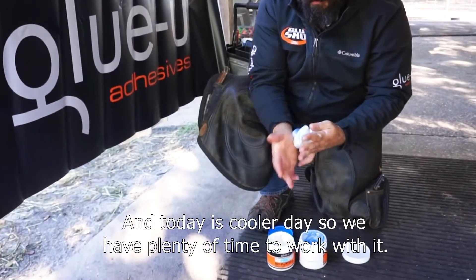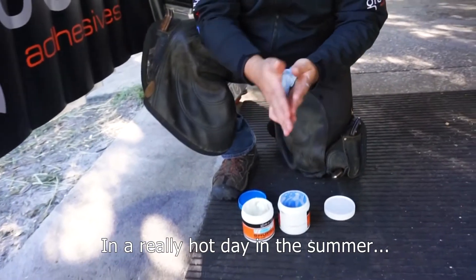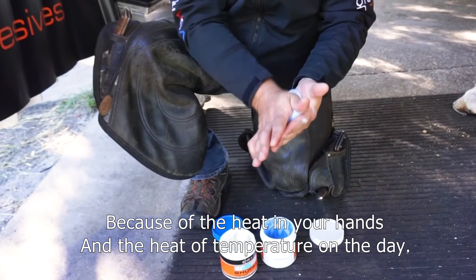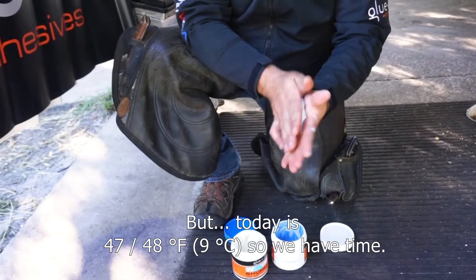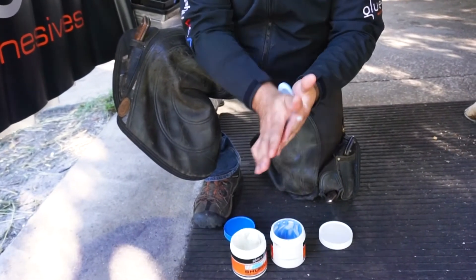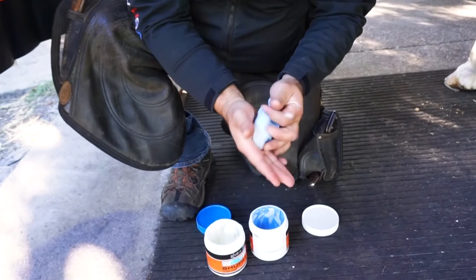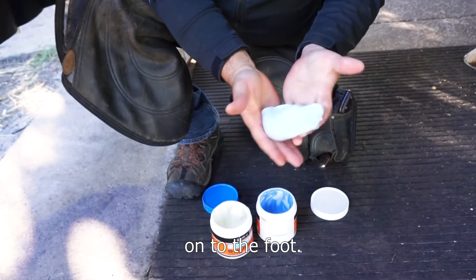Today is a cooler day so we have plenty of time to work with it. On a really hot day in the summer, the more you work it the faster it'll start heating up because of the heat in your hands and the ambient temperature. Today is about 47-48 degrees so we have time. You can see now we have a uniform color — no streaks of white or blue — and we are ready to pack it onto the foot.